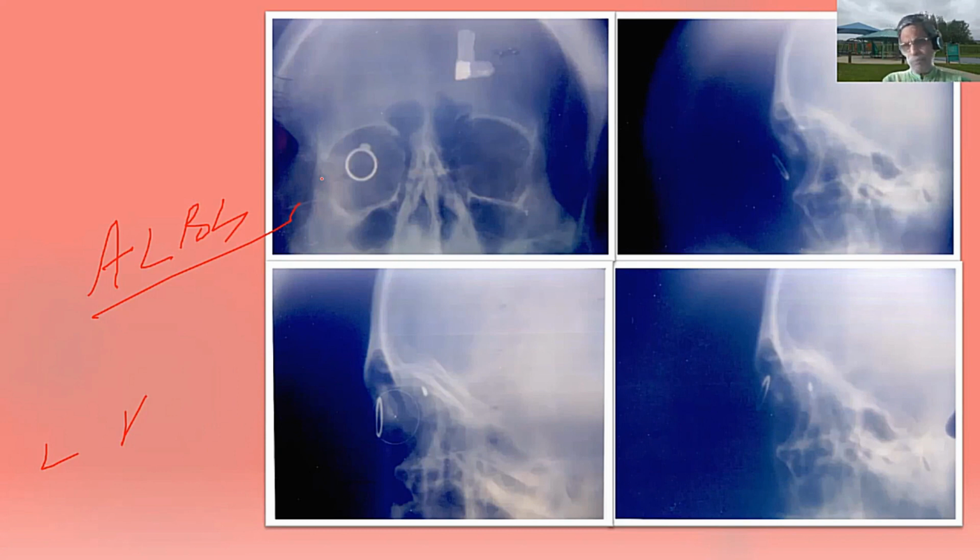Now here's another point for exam questions. They will project this X-ray slide. I'm giving importance first to X-rays because normally we don't do X-rays now. But for exam purposes they will definitely show you in the examination. That's why I'm stressing the importance of X-ray here. Of course, there are other things, CT scan, MRI and all. But X-rays normally we don't do. For exam purposes, you are supposed to know a few things.